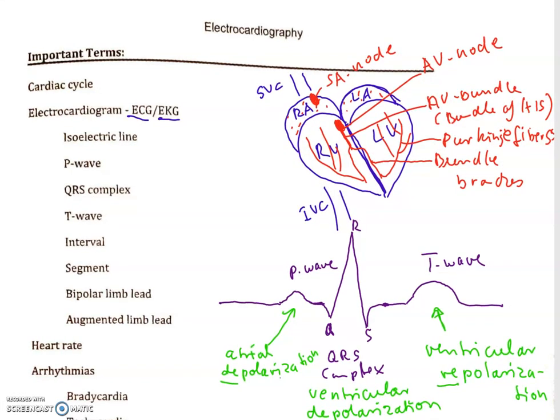Okay. You might wonder if there's a ventricular depolarization and repolarization, how about the atria? Don't they repolarize too? Well, it's true, they do repolarize as well, but the P wave by itself is already not that large. The repolarization wave of the atria is also not very large, and it's masked entirely by the massive electric activity of the QRS complex. So technically your repolarization wave would be sort of a little bump downward deflection like this right here, but you can't see it because the QRS complex basically takes over.